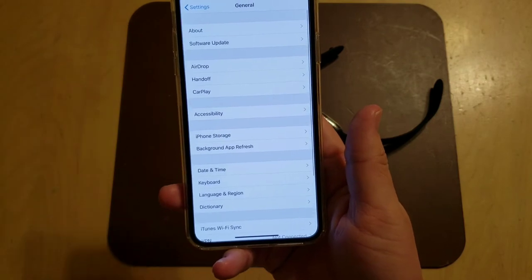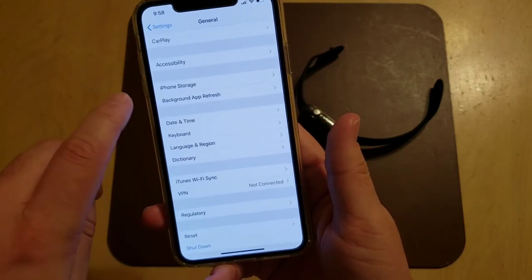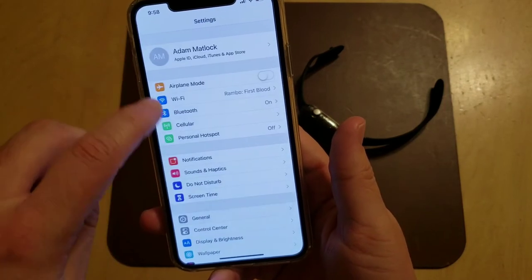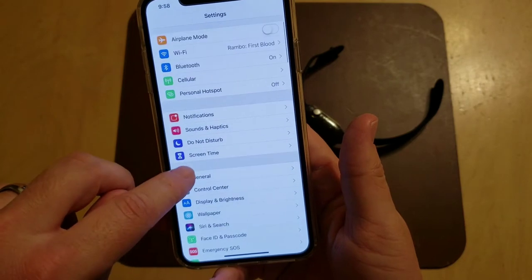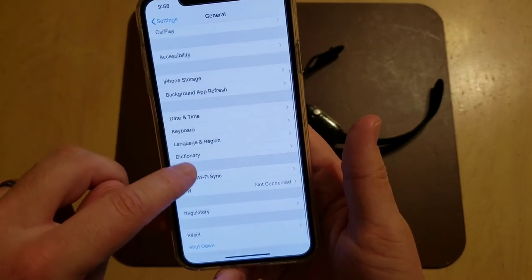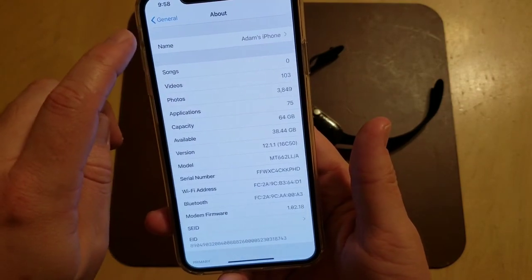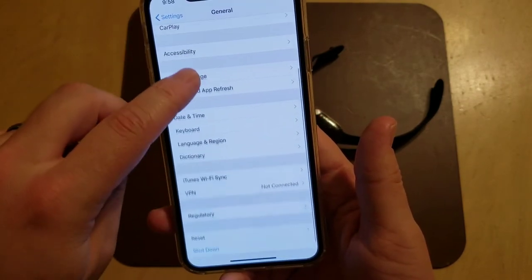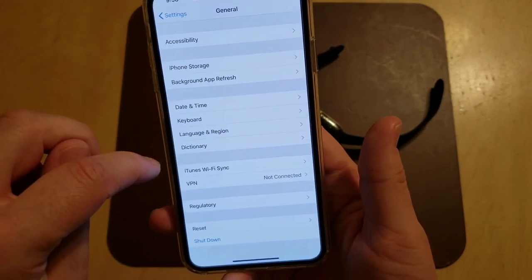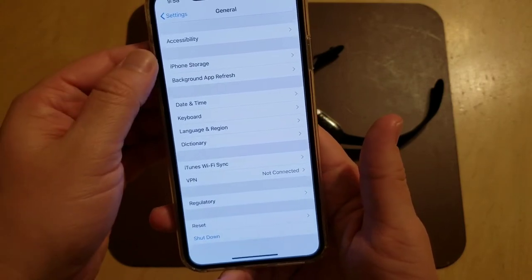If you're running the beta and the ECG feature isn't showing up for you, go to Settings, General — I'm trying to remember — there was a section for Profile. In the Profile section it would show the beta profile, and you have to delete the beta profile, reset the phone, and then update to the official release.